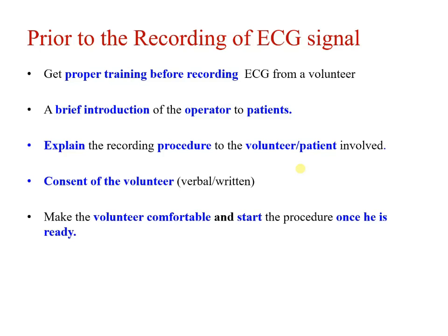So these are the basics of ECG signals. I'm sure you have learned them in detail in the classroom. My motto was just to give a brief introduction to the waves of a single ECG beat. However, the main focus of this lab is to let you know how to acquire a good ECG signal.